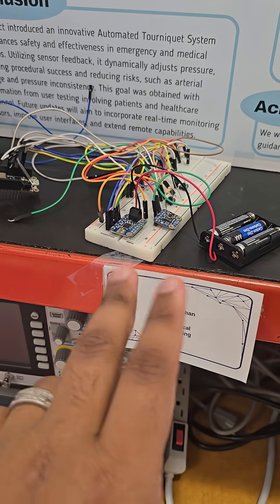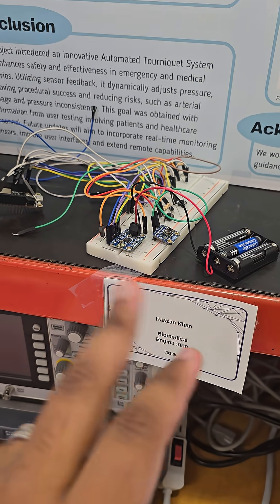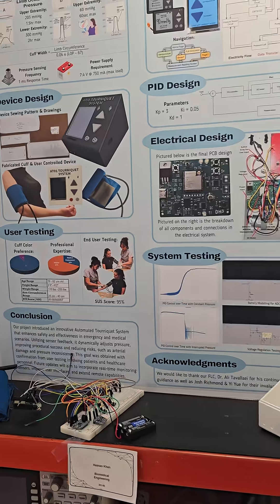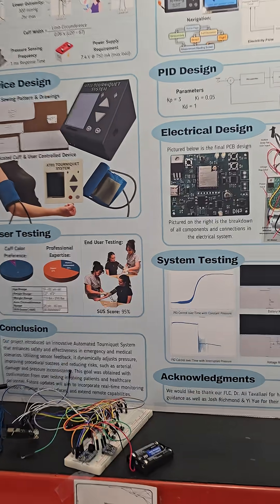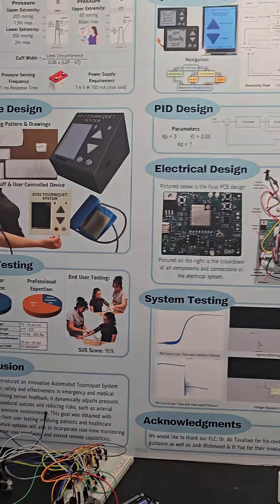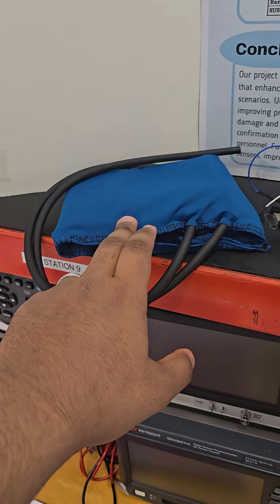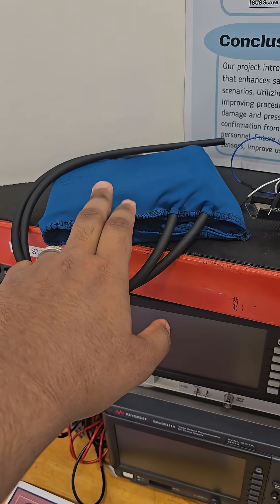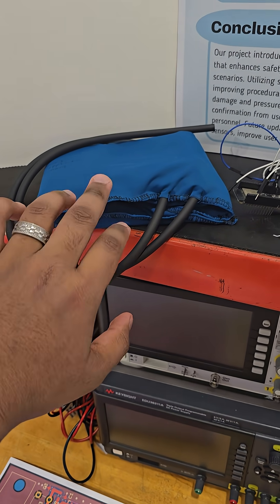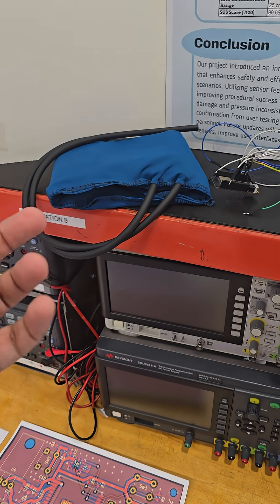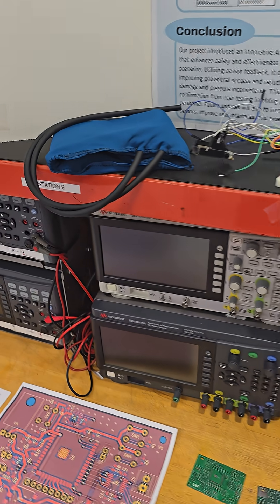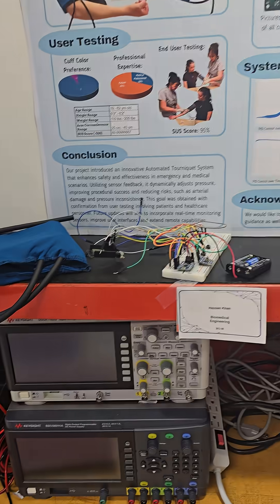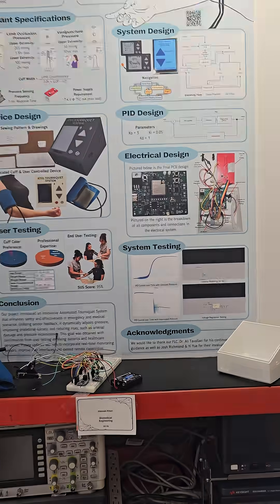We used our board - or sorry, our poster. Here's the first cuff that we made. Inside here we have a level, a cuff, and a bladder. Yeah, that's pretty much it.